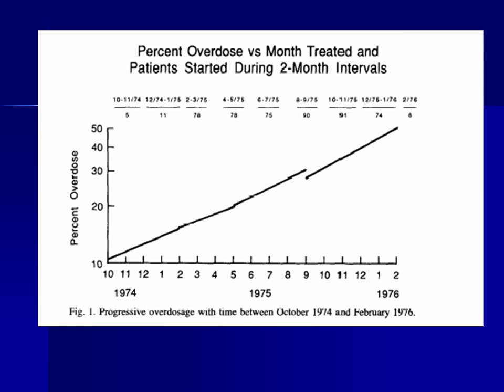And so there was a paper that was published in the Red Journal in '95 that actually was a follow-up to what happened to these patients. And this is essentially what happened. Initially, the calibration was correct, but the way they were decaying, the way this physicist was decaying the activity became more and more incorrect over time until eventually there was a 50% overdose of patients, and they started to see complications in the clinic.